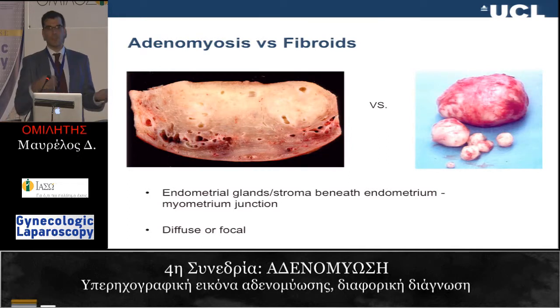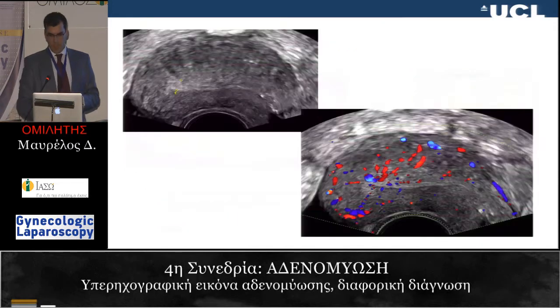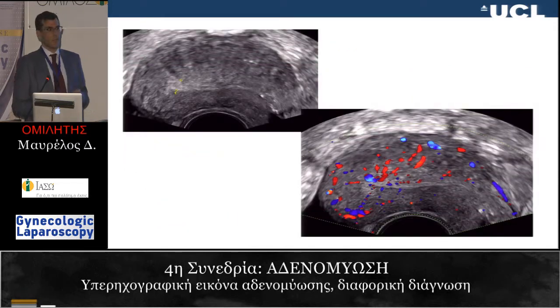She can have both fibroids and adenomyosis, and those conditions can coexist. Another useful trick to be able to differentiate between the two is to use your Doppler. The Doppler button will tell you whether there is circular blood flow around the lesion that you're examining or whether there are these kind of finger-like projections going through the lesion. And if you look at the histology of fibroids, they don't have central vascularity. Their vascularity is peripheral, so if there is central vascularity, it's less likely to be a fibroid, more likely to be adenomyosis.